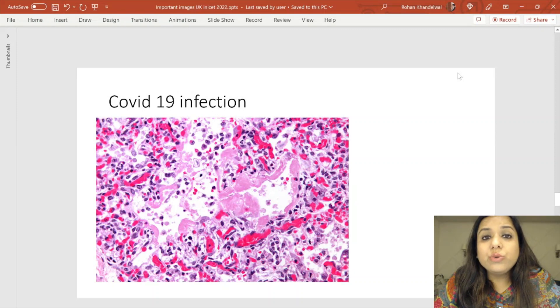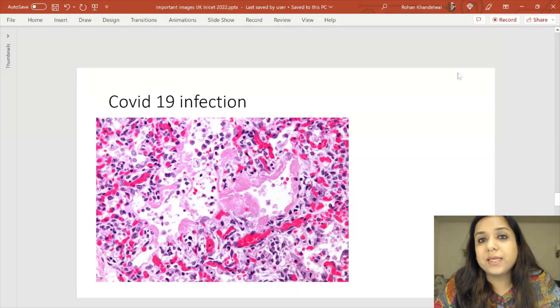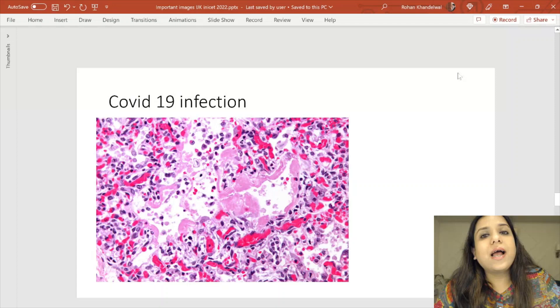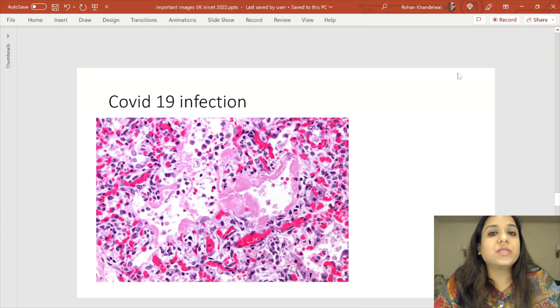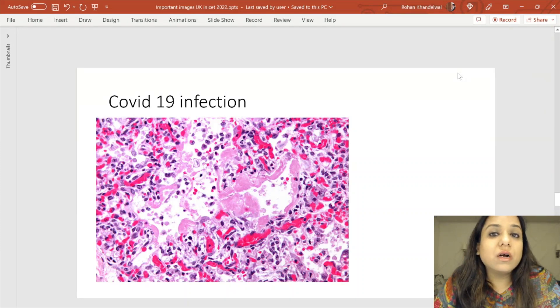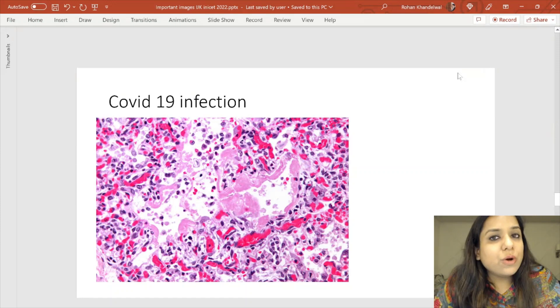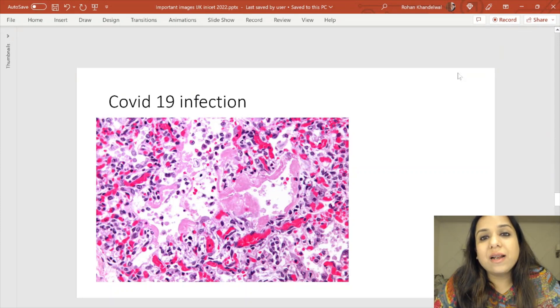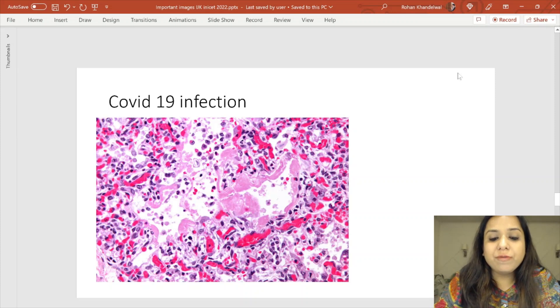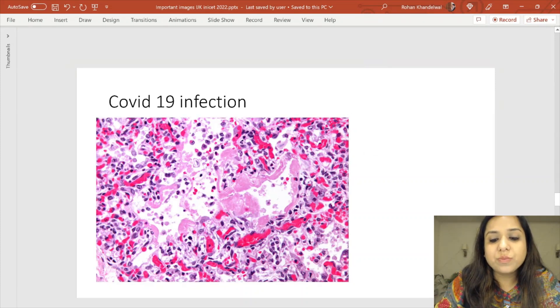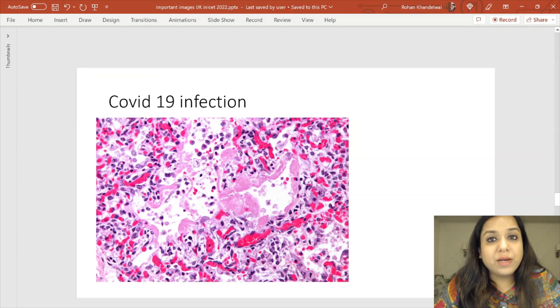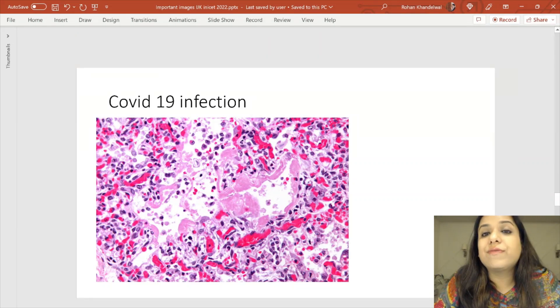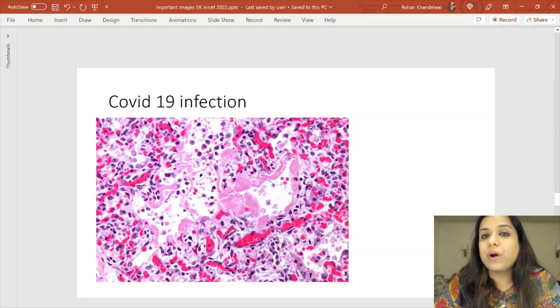Regarding COVID-19 infection: examiners now commonly ask what a lung biopsy in COVID-19 will show. The lung biopsy shows diffuse alveolar damage and pink fibrin-like material. The pink fibrous material present in the alveoli is basically fibrin, and this pattern is called diffuse alveolar damage.